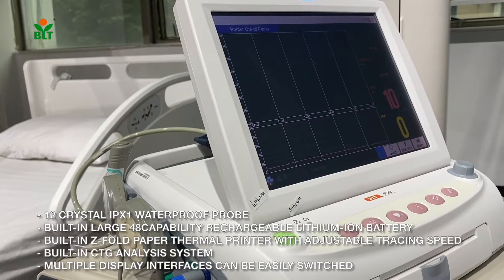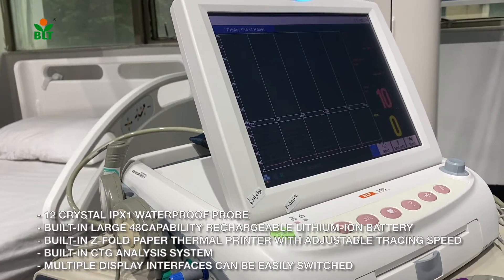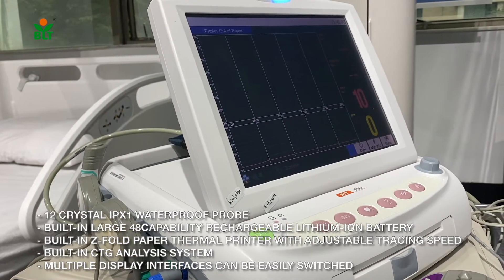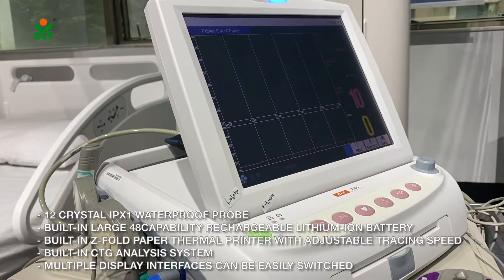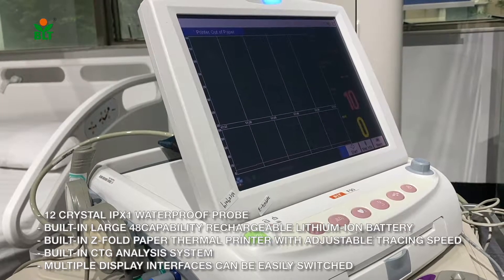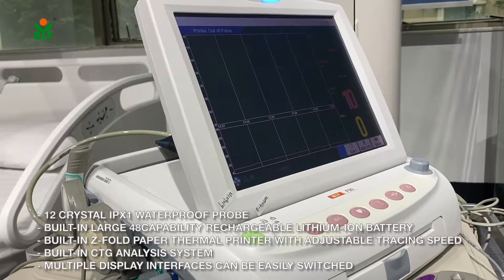It features a built-in large capacity rechargeable lithium-ion battery, a built-in Z-fold paper thermal printer with adjustable tracing speed, a built-in CTG analysis system, and multiple display interfaces that can be easily switched.